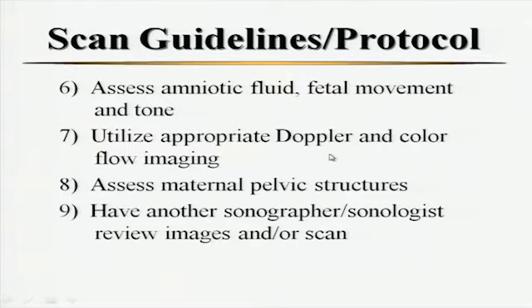Add the Dopplers if the baby's measuring small. Assess the maternal pelvic structures, and then if nothing else, go ahead and get another sonographer or your doc to come in with you. Get a second pair of eyes. Sometimes that's what you need.